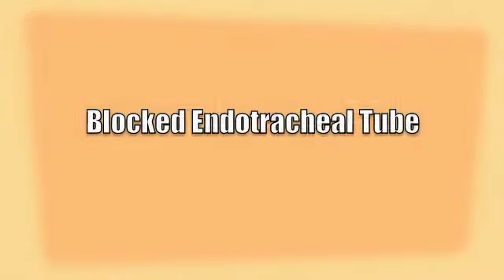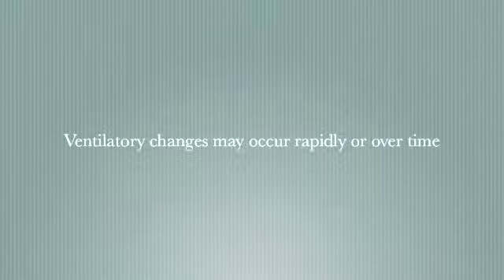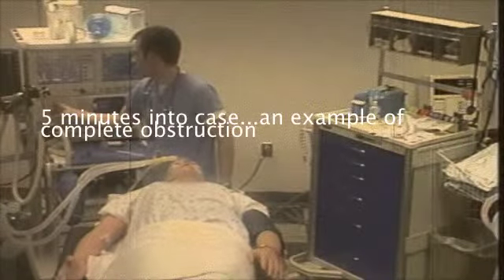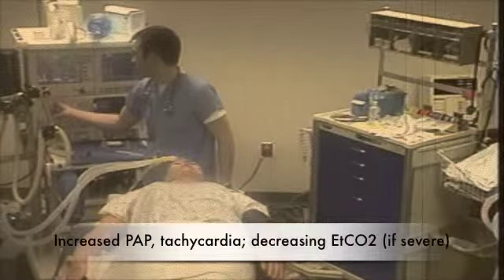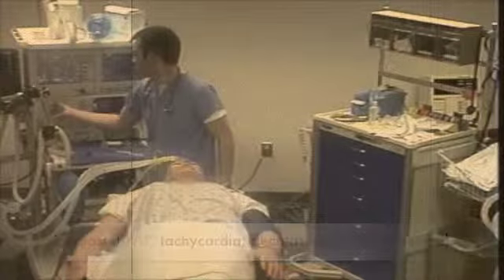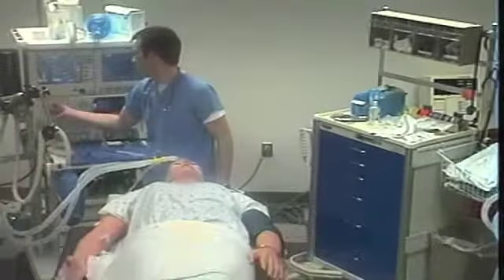Common causes of a blocked ET tube include biting, kinking, external compression, secretion accumulation, and intraluminal material accumulation. Depending on the cause, ventilatory changes with mechanical obstructions may develop over several minutes or in seconds. Peak airway pressures are noted to be increased. Tachycardia is also observed. The end-tidal CO2 will be decreasing. Note the slow rate of rise in phase 2 and little to no phase 3.